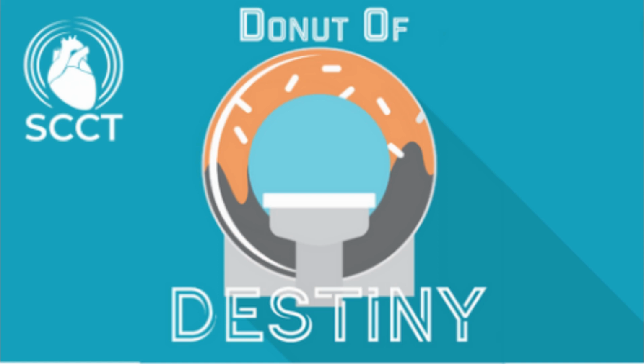Before we delve into Partner 3, let's get a little history. There have been bad fears about outcomes related to HALT with TAVR that first arose actually after a suspicious case report back in 2013 where Patch et al. described hypoattenuation on a single cusp that occurred 7 days after implantation of a 29mm Sapien XT transcatheter valve in a gentleman who's quite old, he was 86 years old. This hypoattenuation resolved following the initiation of Coumadin anticoagulation, suggesting that this finding was indicative of a bioprosthetic leaflet thrombosis.